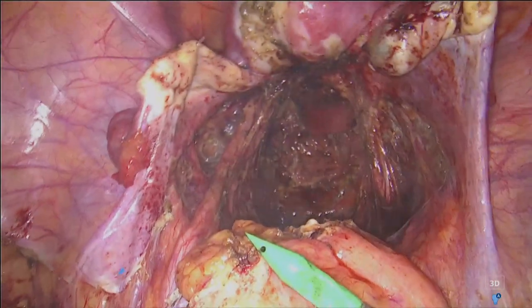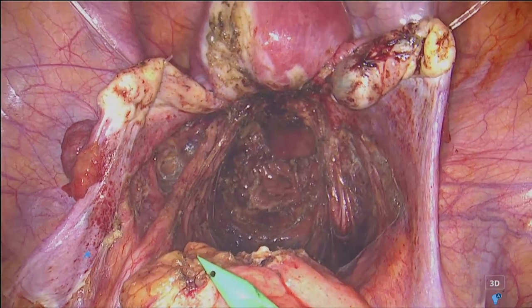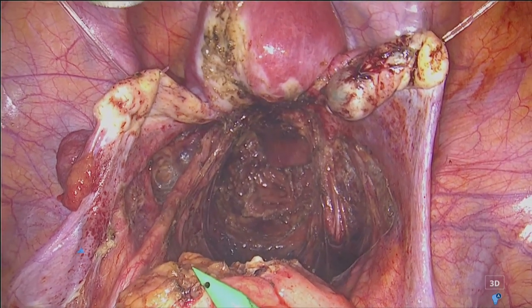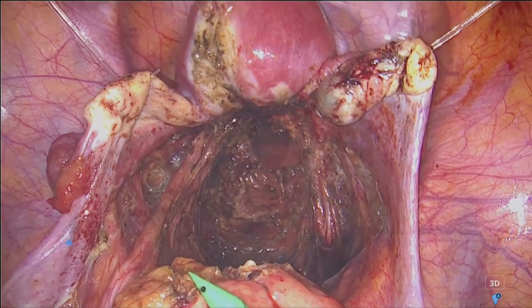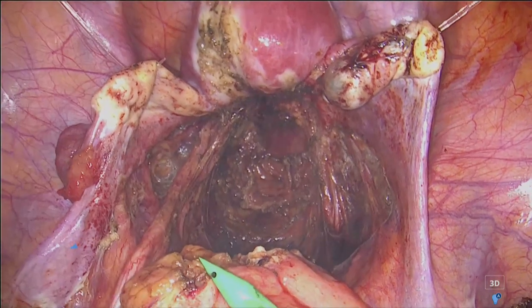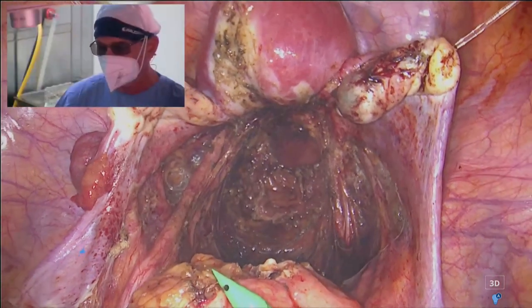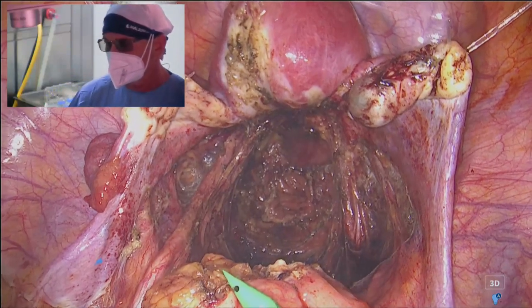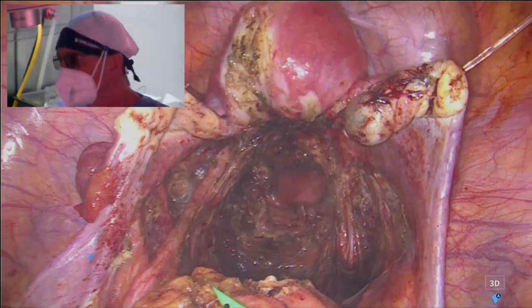It's no good the transrectal evaluation, because with a transrectal probe you push the nodule inside the muscularis of the rectum, and you can underestimate the infiltration in the muscularis of the rectum. So the scan is through the vagina, and sometimes it's transabdominal to evaluate the right colon, the ileocecal valve, the appendix, the ascending colon, the ileum, and the kidney, of course.